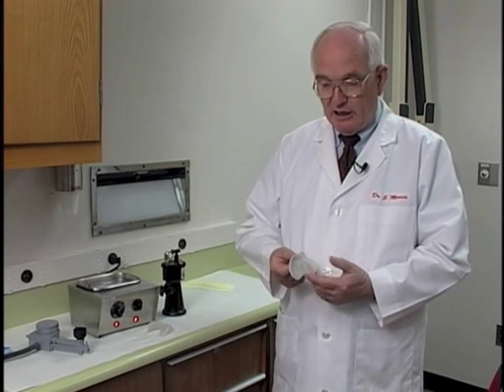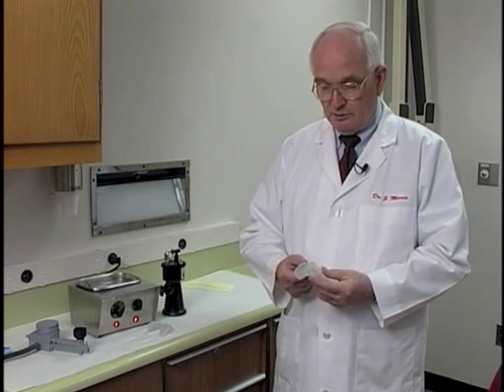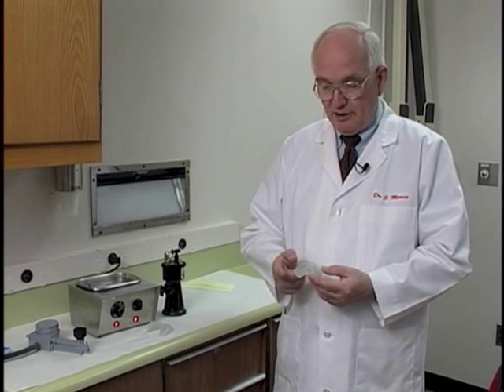This is the maxillary tray that has been constructed, and our object today is going to be to try this tray in the mouth and see that the peripheries are at the length we would like them to be. If they're not, we will need to adjust them.